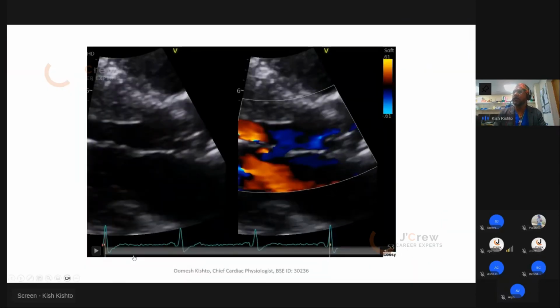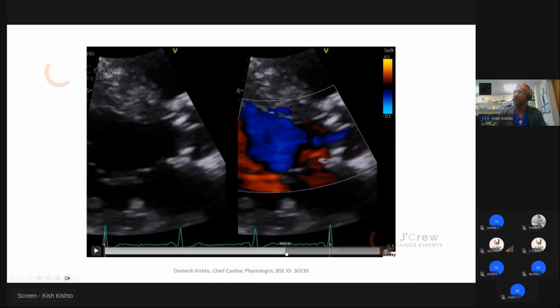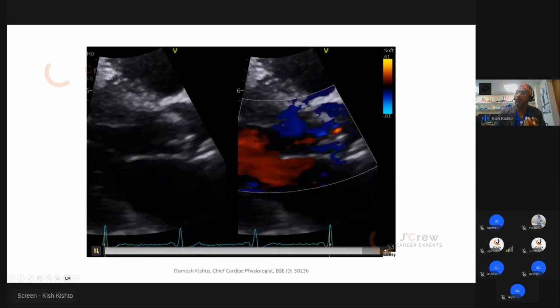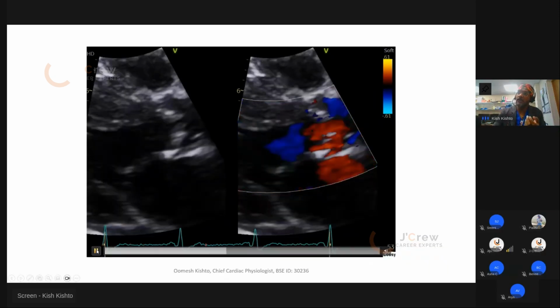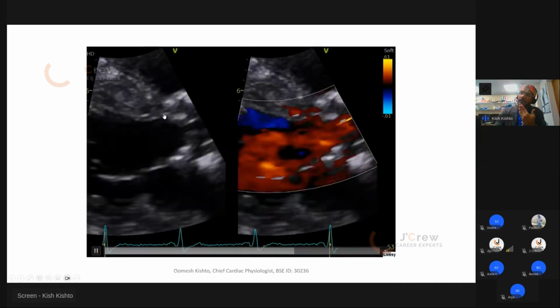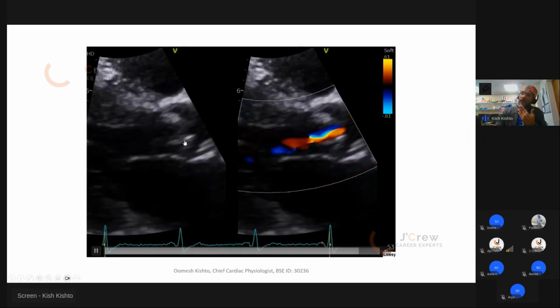So clearly here, you can see that's opening. The basal part of the aortic valve, as you can see, is heavily calcified and quite fixed, from what we've seen cross-sectionally. Only the tip is moving a bit, okay? And if you keep looking at it, you will see that's fairly fixed, and the non-coronary cusp is a bit mobile compared to that one.